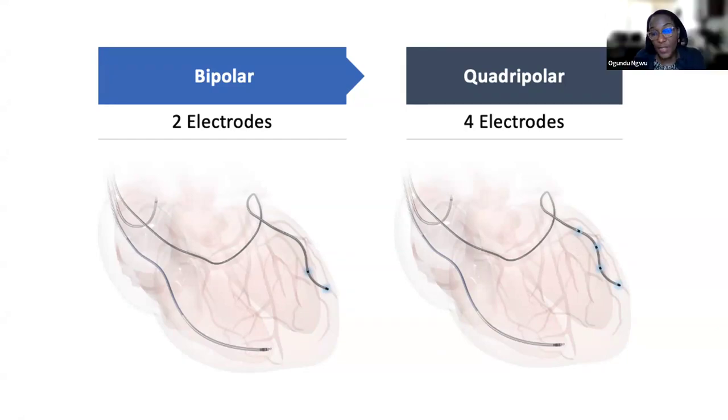Yes, that is absolutely correct. Bipolar leads are absolutely useful and can be used. And as AJ said, at the beginning of CRT, we would stay like 6 hours in the lab because you had only a unipolar option, and then you get in there and there's diaphragmatic pacing that you have to come back, go to a different vessel, try a different vessel. So it's not that it doesn't work. It absolutely is just as effective.